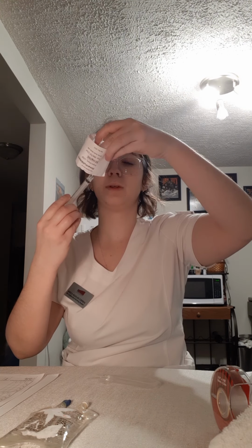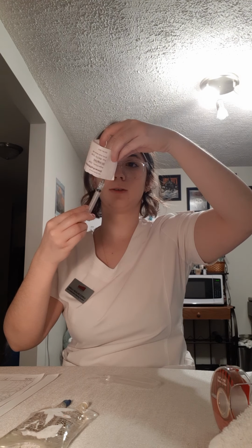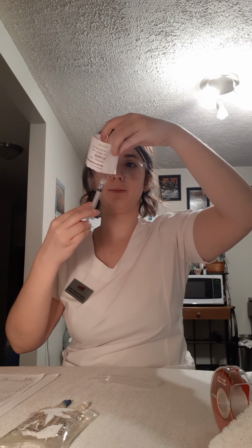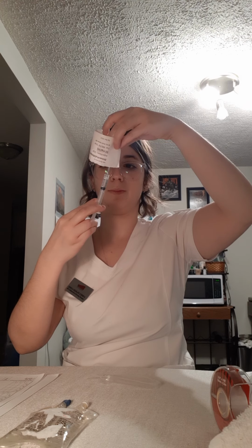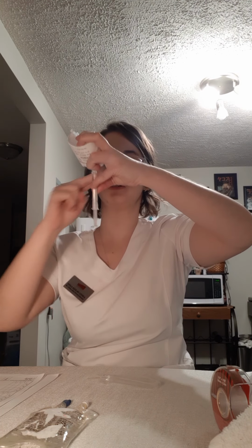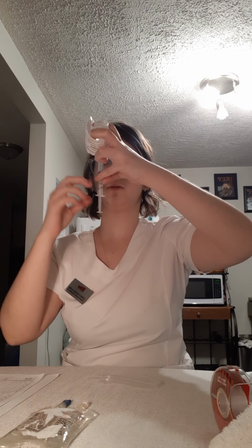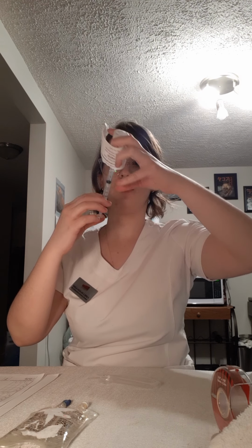Okay, and I'm going to inject it. I'm going to inject it, and I'm going to take out a bit over a milliliter. Okay, it's perfect. Okay, and now make sure there's no bubbles. Okay, perfect.